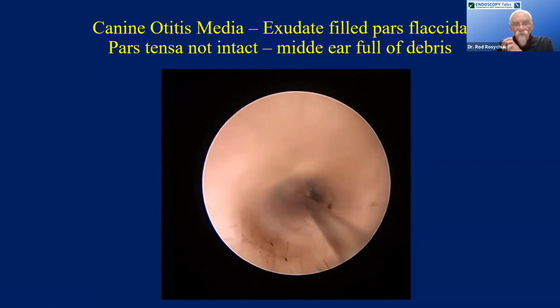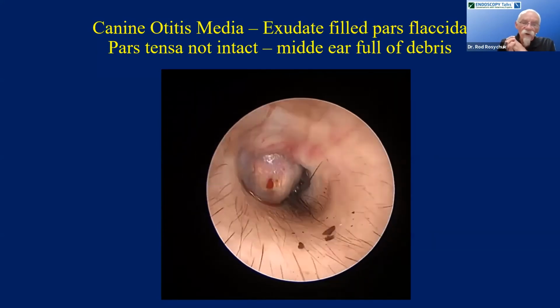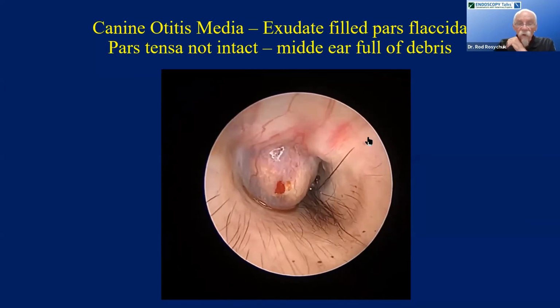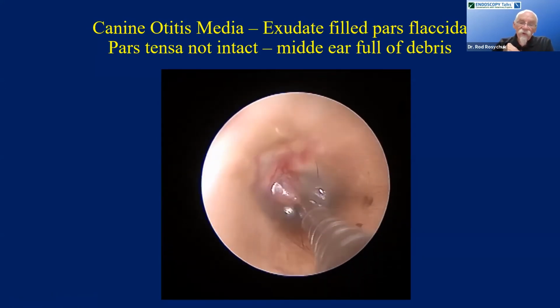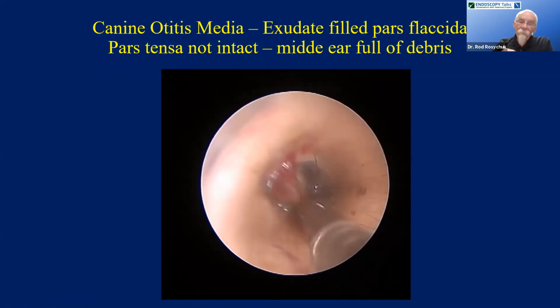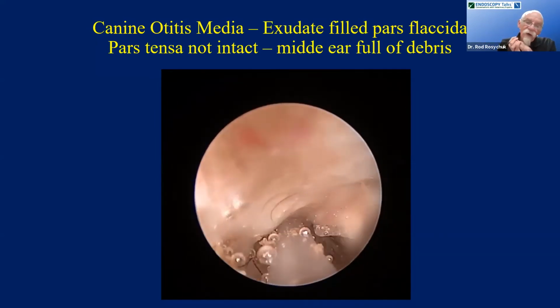These tympana are very pathologic, usually they're very thickened. Nowadays, what I find myself doing is making a bigger hole in that pars flaccida. And we do that with our biopsy forceps, basically grabbing that pars flaccida in its more ventral orientation. And you'll see as I pull this hole open here, that material will pop out of that dilated pars flaccida, and we'll flush that material out.